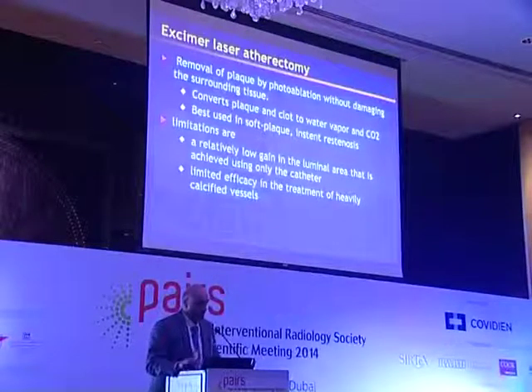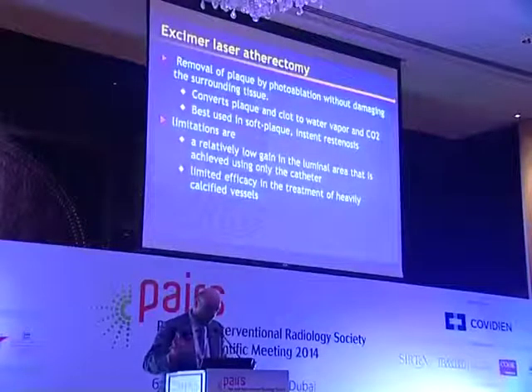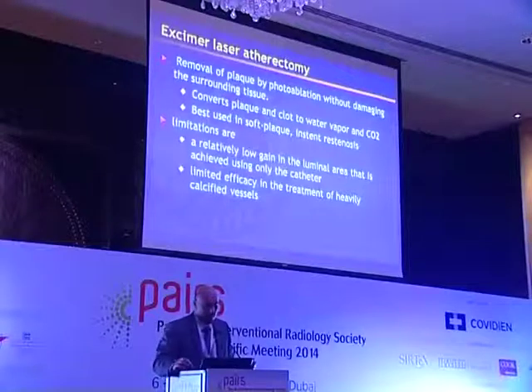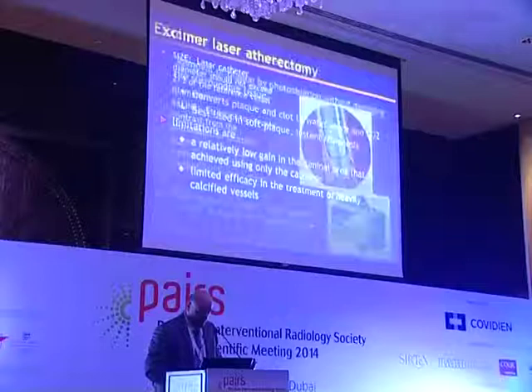The other 3 devices do work on calcium. This device absolutely does not work on calcium. They say that, yeah, you can use it gingerly in calcium, but actually it doesn't. So one of the limitations is the relatively low gain in luminal area compared to some of the other devices. And I mentioned it doesn't work well for calcium.